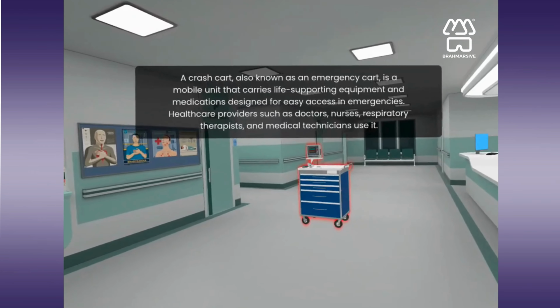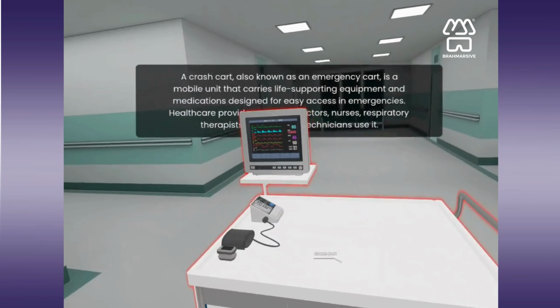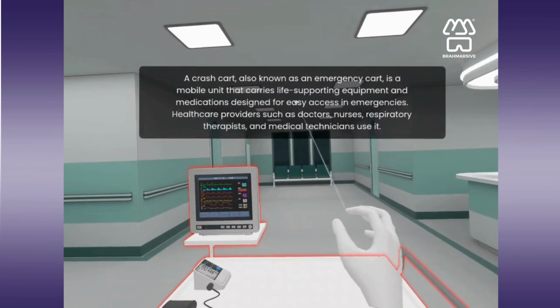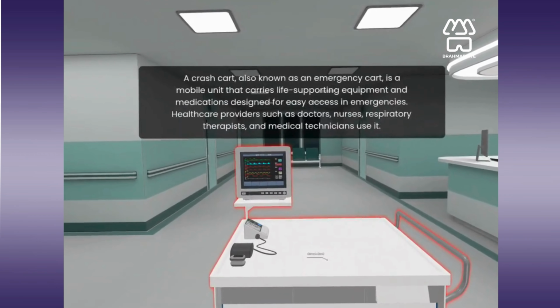A crash cart, also known as an emergency cart, is a mobile unit that carries life-supporting equipment and medications designed for easy access in emergencies. Healthcare providers such as doctors, nurses, respiratory therapists, and medical technicians use it.